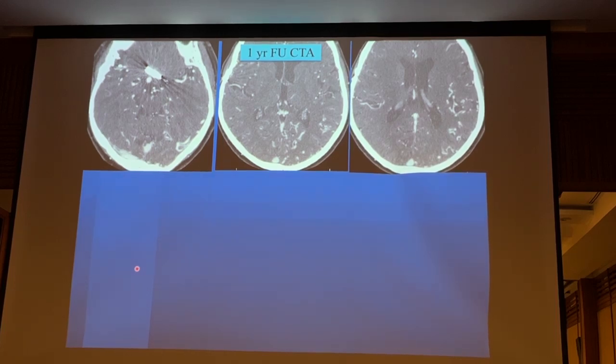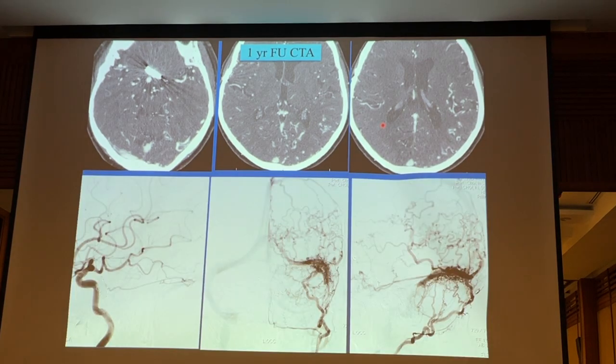What do we have? We have multiple dilated vessels, okay? All over the left side as well as the right side. And this is the angiogram we did. The angiogram shows certainly she developed, meanwhile, this complex dural arteriovenous shunt with occlusion of the distal sigmoid sinus.